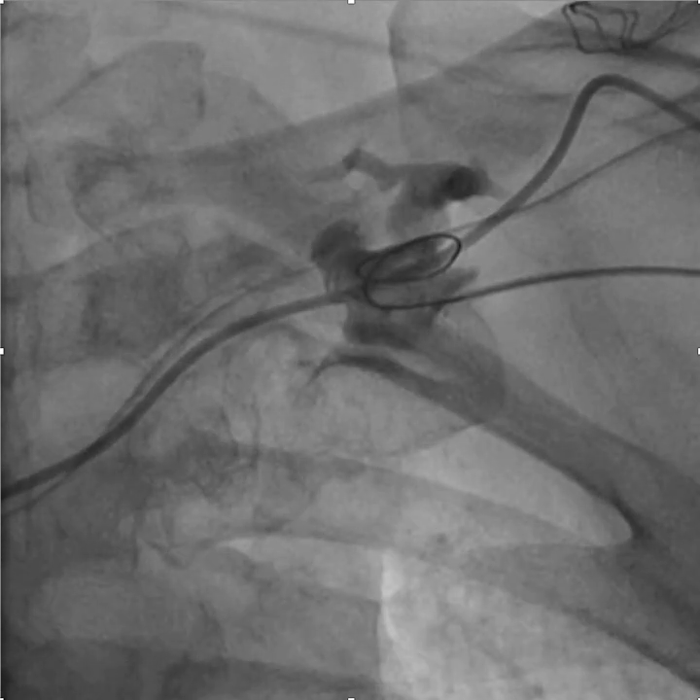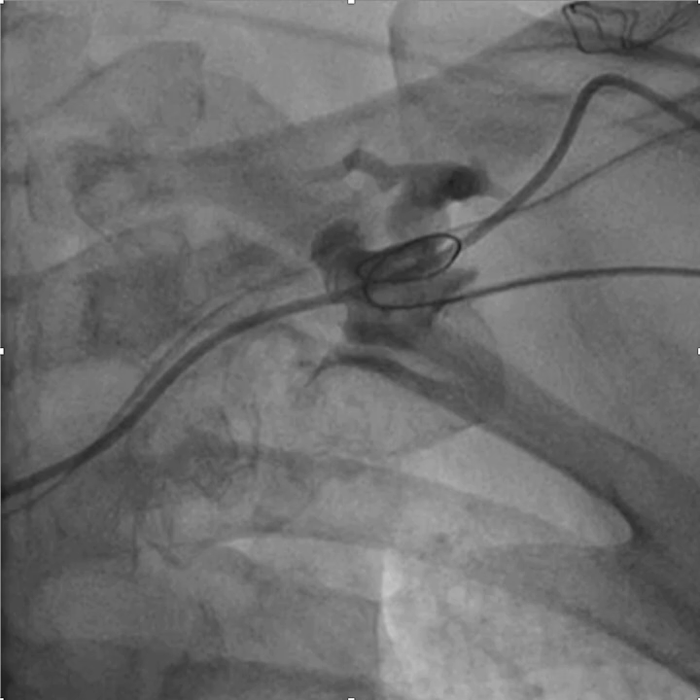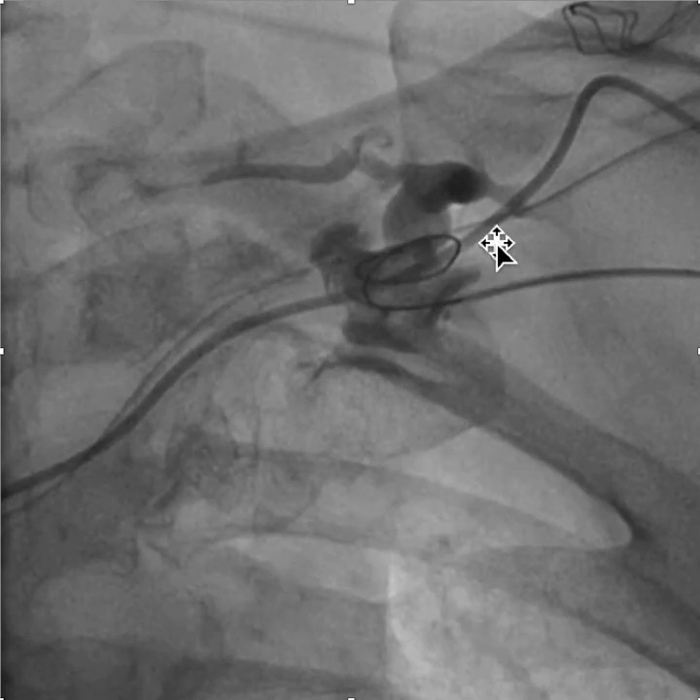This video describes how to use focused force venoplasty when the balloon is inflated but the waist doesn't go away. We have a tight stenosis and a previously failed implant because of the tight stenosis in the subclavian.